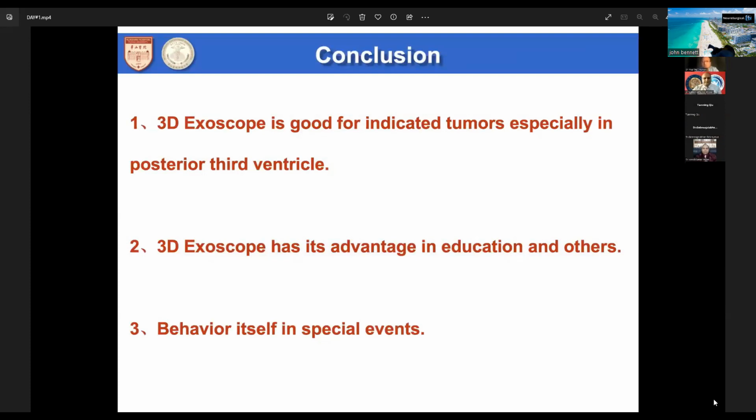It's an original purpose. And also in the last 3 years, we all suffered from the COVID. And in the COVID, for some emergency cases, with the microscope, we have a mask ahead of our face. It's quite difficult to do the microscopic manipulation. But for this kind of 3D exoscope, it's quite easier because there is a distance between the equipment and the patient and also the surgeon. So this is quite easier for this kind of exoscopic cases.